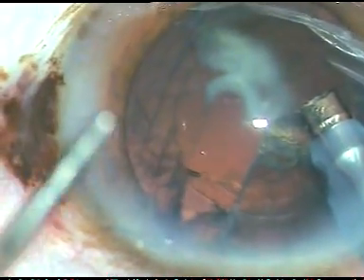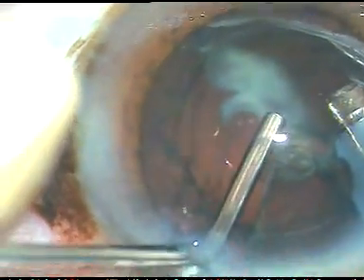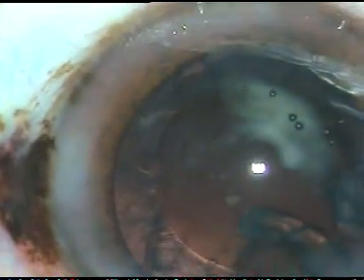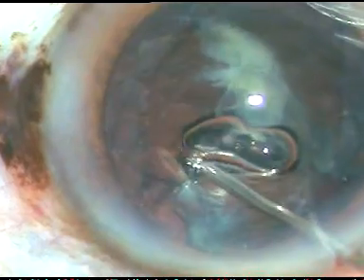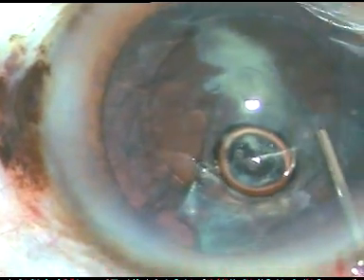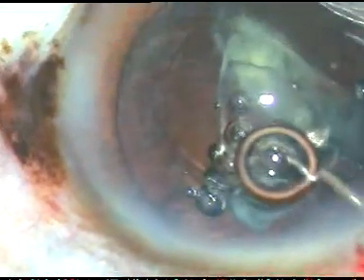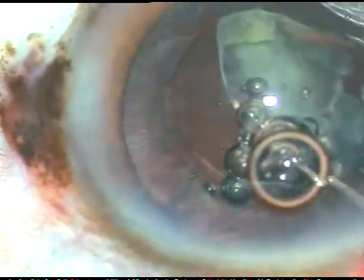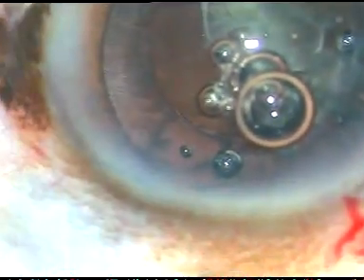So I inject viscoelastic substance — this is HPMC — and take out the phaco handpiece. And now I am going to use Viscoat. This is Viscoat expressed out, some HPMC depressing the posterior lip of the main incision. Injected Viscoat to seal the PC rent. And I want to see if I can emulsify this epinucleus piece.